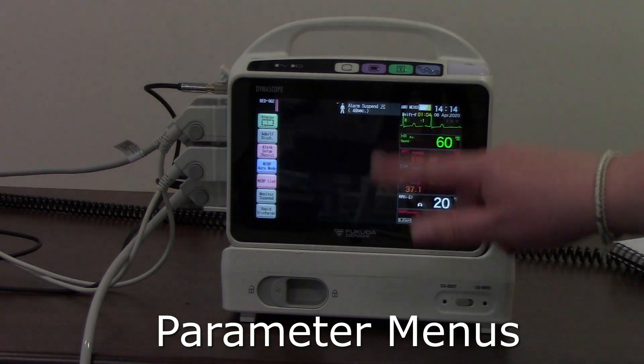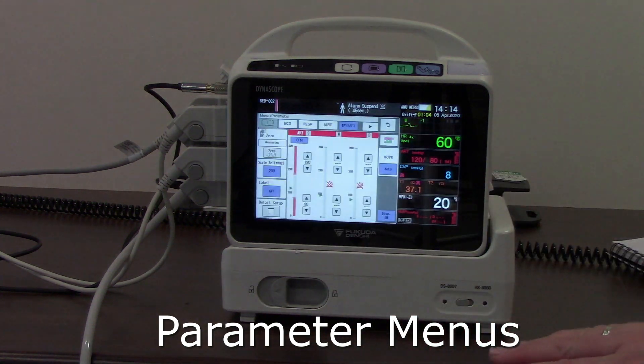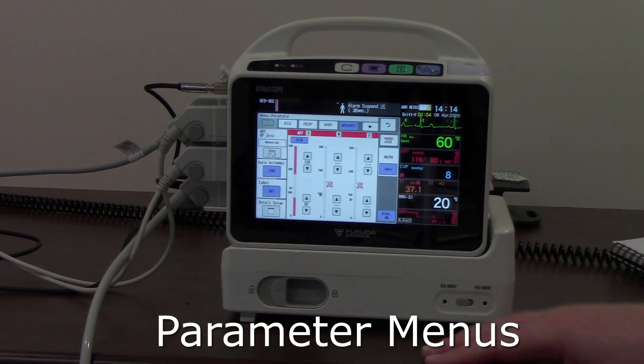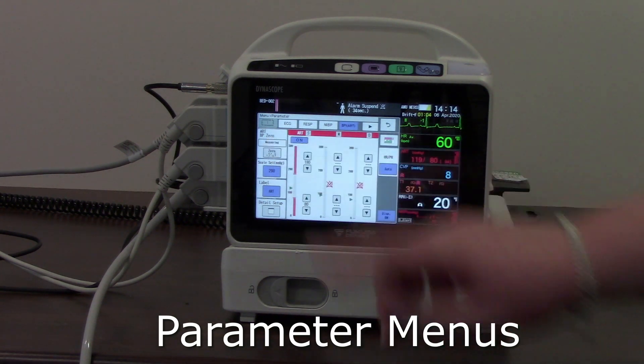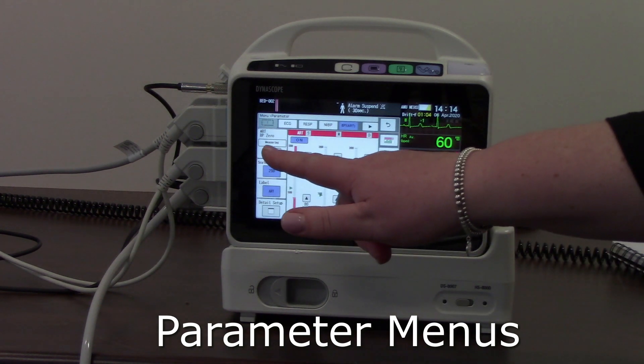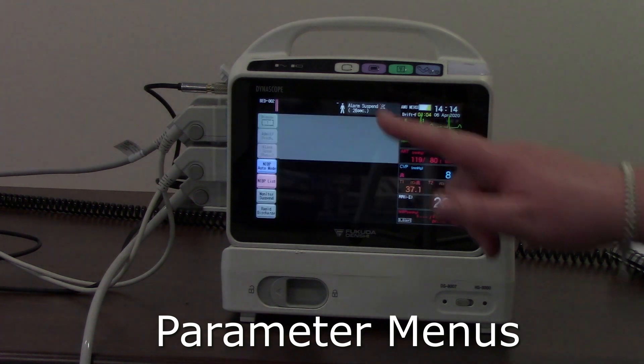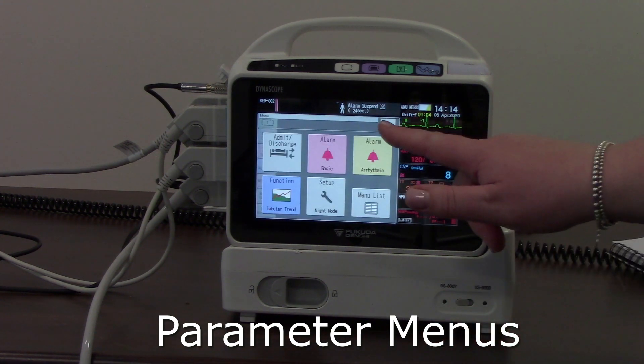Every parameter is set up in exactly the same way. If I go into my arterial line parameter, you can see it brings up a very similar window and menu. One difference with CVP or arterial line is you have a calibration or zero button here — just press it and it will calibrate your arterial or CVP line, depending on which one you've opened.